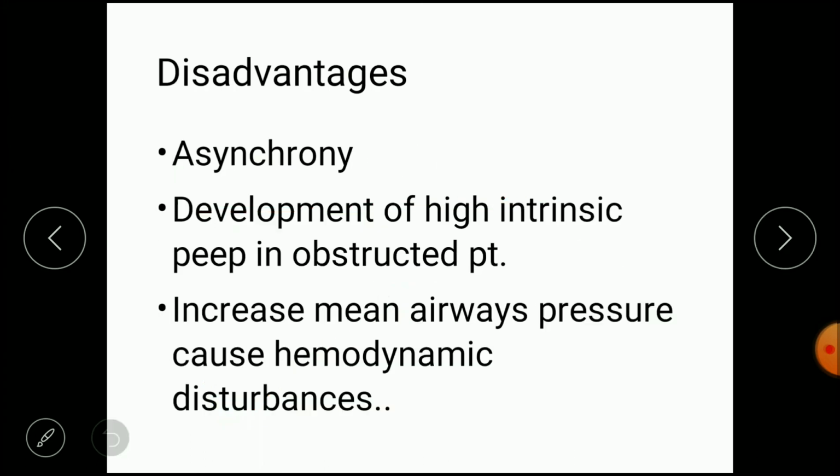Next, we talk about the disadvantages of this assist control mode. That is asynchrony. Here also asynchrony is present, because the patient initiates and after that the machine provides the tidal volume. So there is asynchrony with the patient's breathing, and then development of high intrinsic PEEP in obstructed patients.